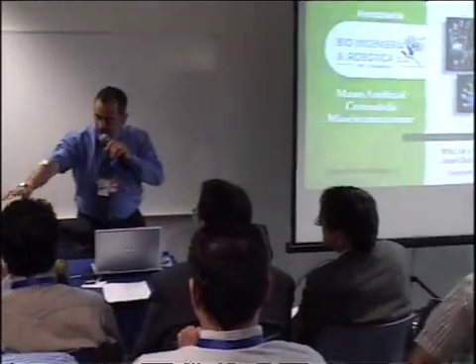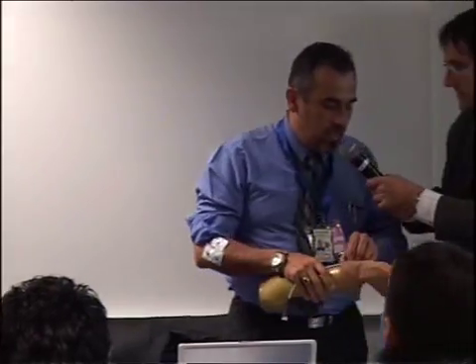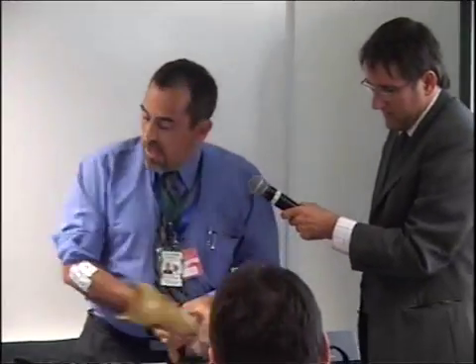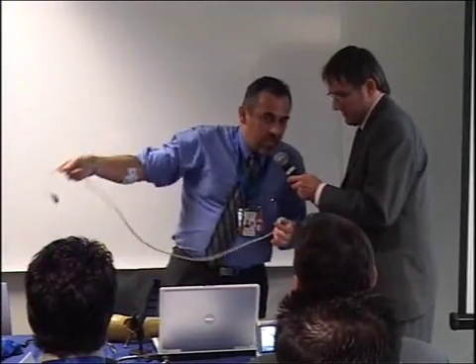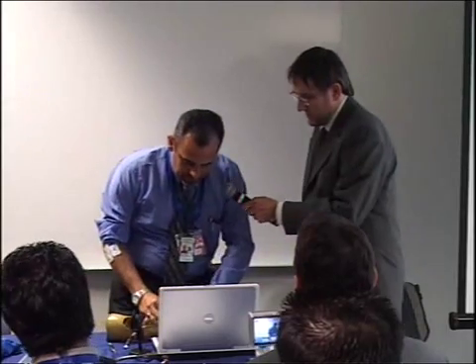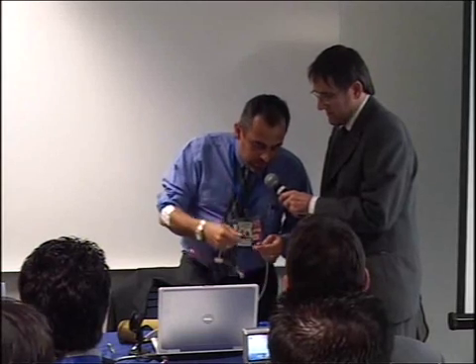I simply placed the disposable electrode system on the muscle channels, flexor and extensor. And this is the prosthesis. The connector is here. I can show you where the card is. This is an extension cord. The connectors for the leads.